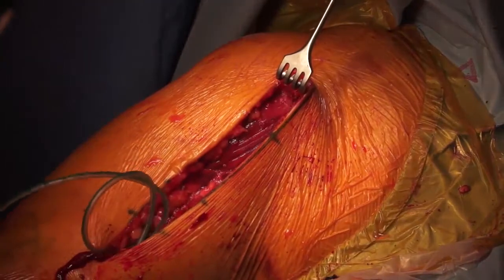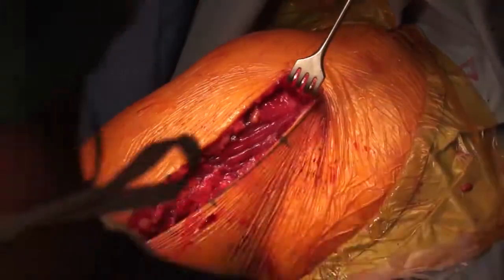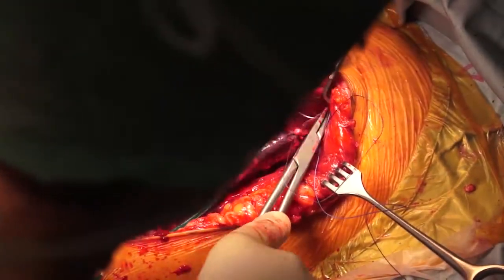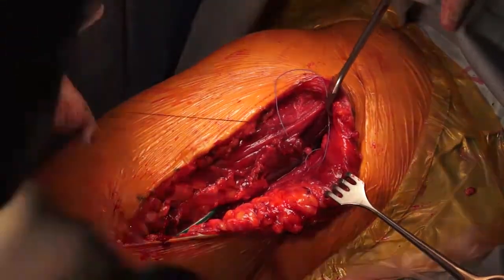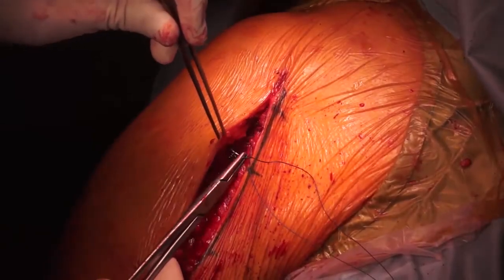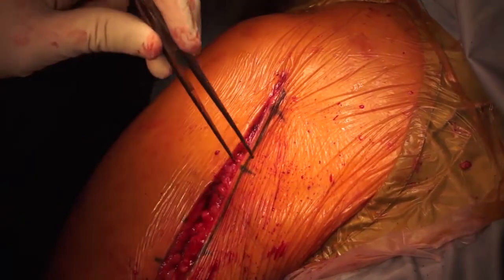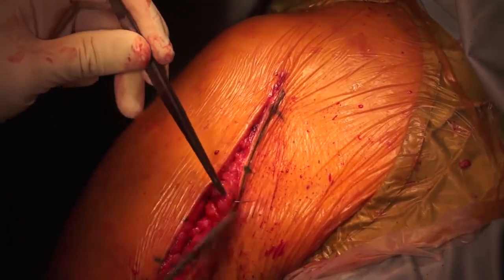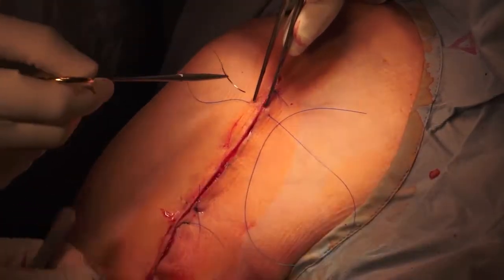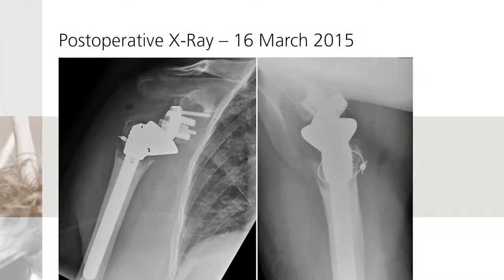Placement of suction drainage. Adapting muscle sutures. Subcutaneous sutures and closure of the skin. Follow-up x-ray at 4 days post-operatively.